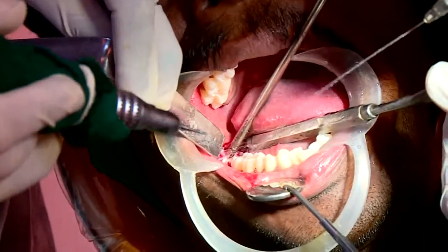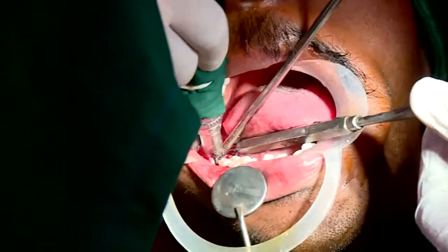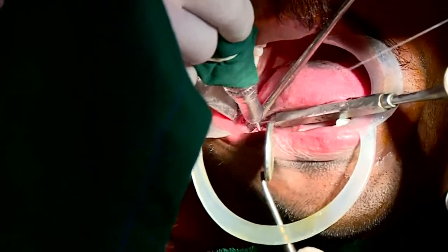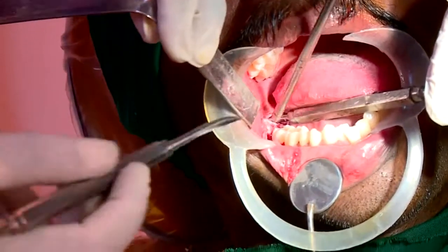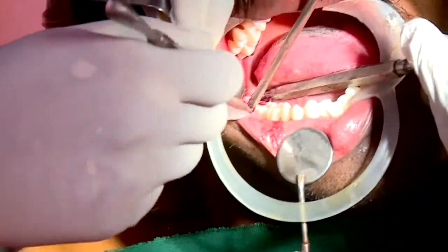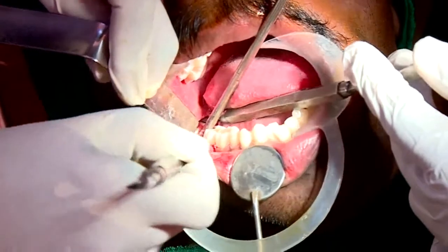The steps in removing all impactions are nearly the same.